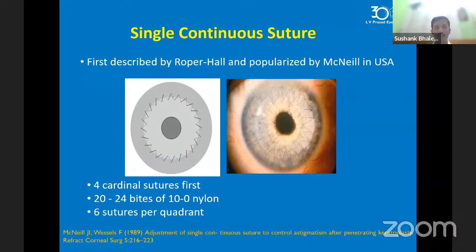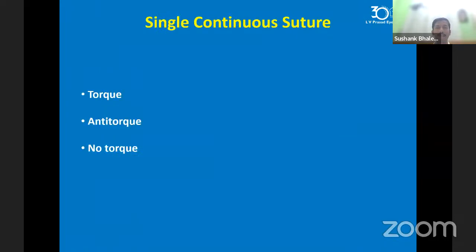He or she can practice in the wet lab very well, about 20-25 keratoplasties, and then they can go ahead with assisting the surgery with your professors or consultants, and observe keenly through the microscope as well as outside the microscope. I request you all to practice sutures with both of your hands. It will really help you, and then you will not complain that the patient's nose is coming in between while suturing. You'll never complain like this when you practice sutures with both hands.